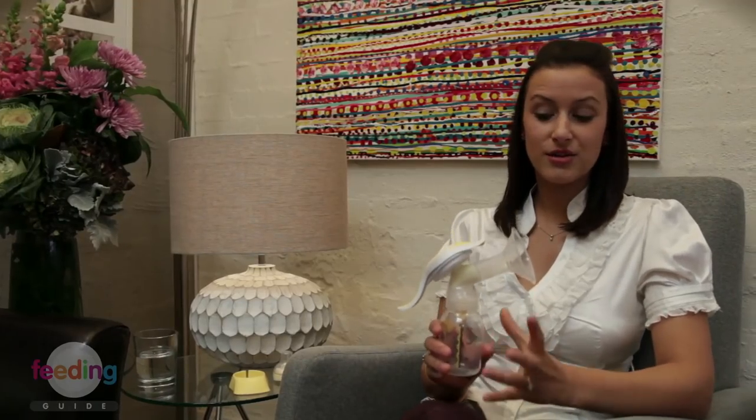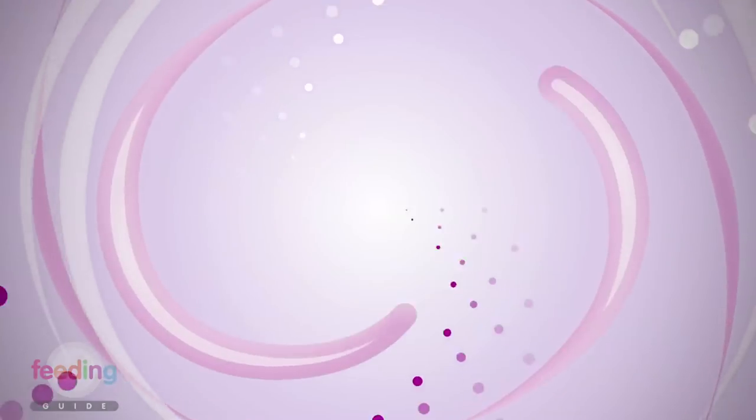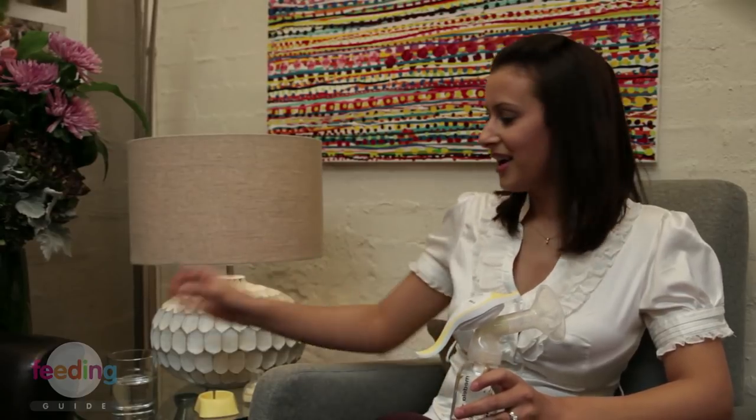Now I'm going to show you how to use the manual pump. It's a good idea to start with your fullest breast first. I've found using a manual pump like this particularly helpful for cracked or grazed nipples or to relieve discomfort from engorgement in those early days. Before you start, make sure that you've got everything that you need handy — I always like to have a glass of water with me because it is thirsty work.